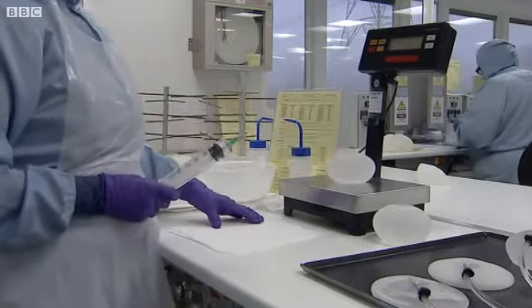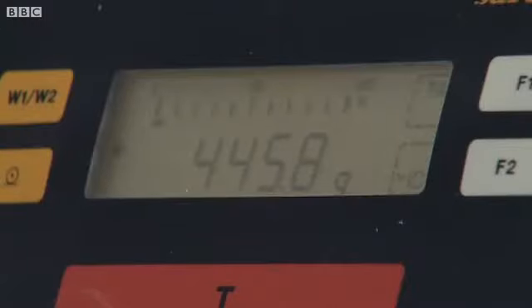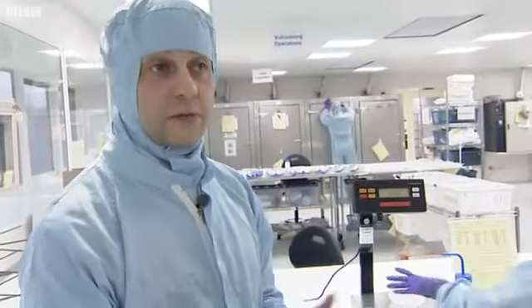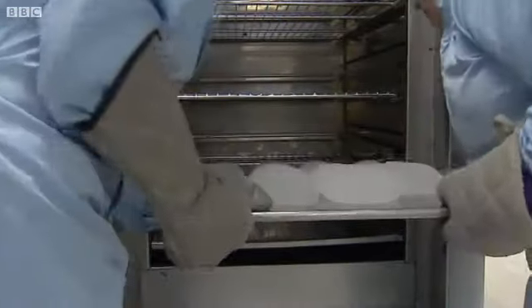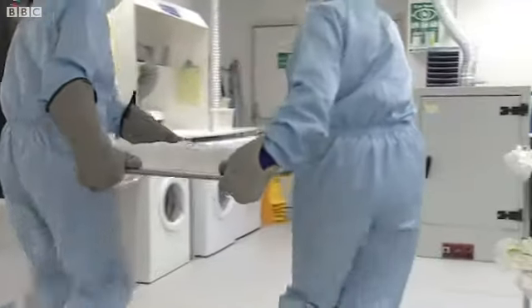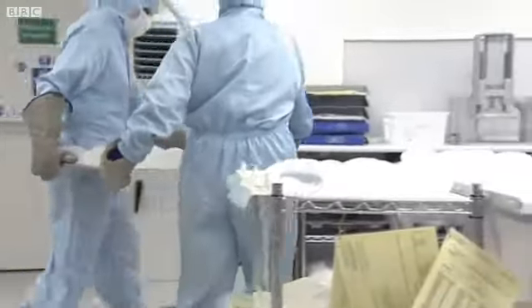Having gel filled the product, we then process it through a de-airing phase to ensure all bubbles and air is removed from the product. At that stage, having been satisfied with that, we then seal the channel that was previously created to enable us to inject the gel. We then put the product into the oven and cure it for the required number of hours that are needed to substantially and fully cure the gel. Having cured the product, it then comes out, final inspection again, and then it will be packaged accordingly.